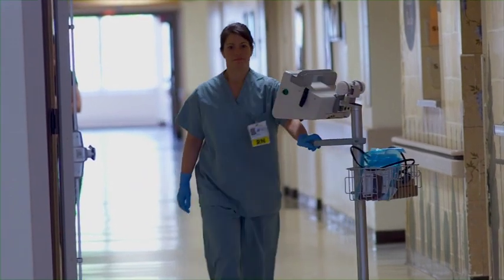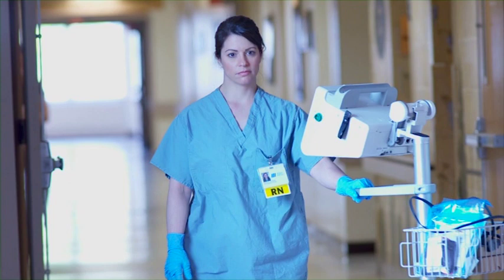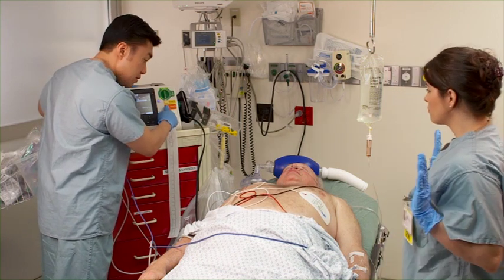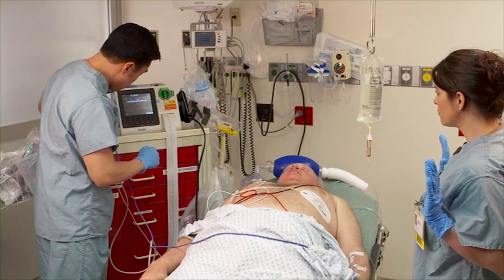The HeartStart XL Plus Defibrillator Monitor uses our clinically proven and patented smart biphasic waveform to deliver a versatile device that's ready to respond to any in-hospital cardiac emergency. It combines a comprehensive set of features in a device that offers easy-to-use, intuitive operation.